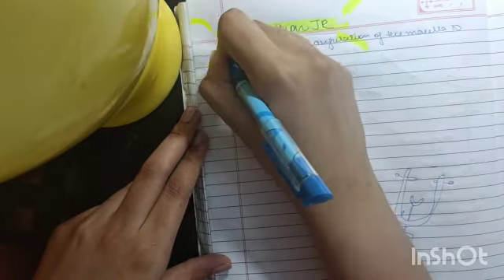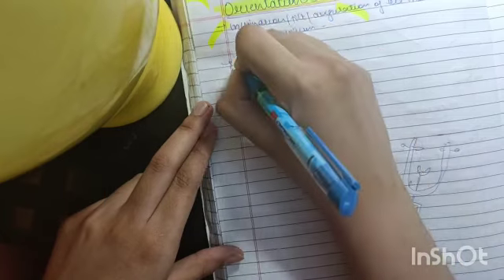For recording jaw relation in orientation plane, we need a face bow.